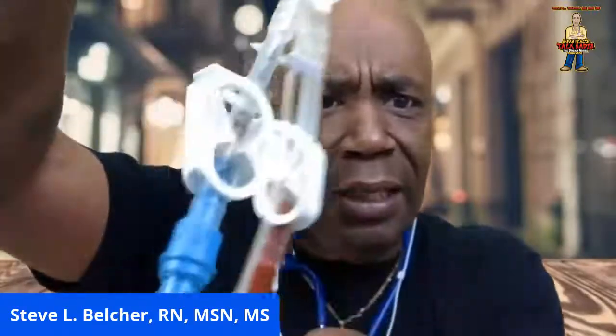Open these up. Go back to the chair. Open these up. Of course, with gloves and a mask. And we unclamp these clamps on the side, instill the medicine, right? Clamp it, and then we come back. It needs to stay in anywhere from 30 to 45 minutes to break down the clot. After that time, if we still are not getting the flow, we can repeat the process. By that time, we got blood.